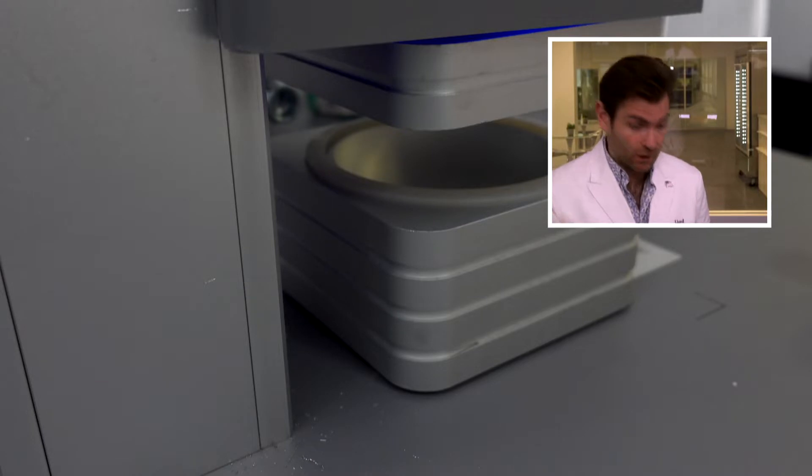Hey everyone, welcome back to the place where we test every single mask in the world. Today we are testing masks from India — including the CareVu mask. It's a soft touch box. Let's put it in the clamper and go.